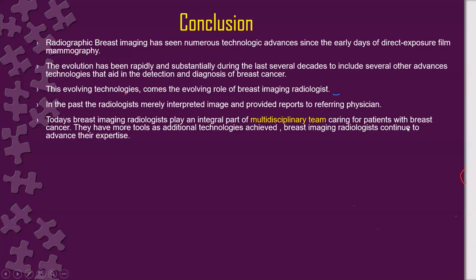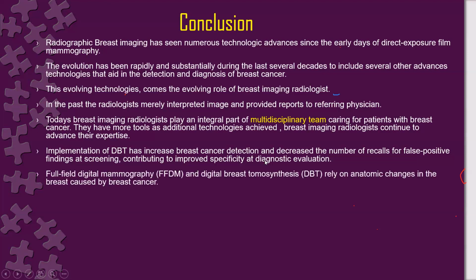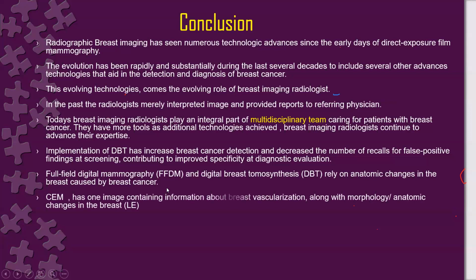Breast imaging radiologists continue to advance their expertise, and the implementation of tomosynthesis has increased breast cancer detection and decreased the number of recalls from false positive findings at screening, contributing to improved specificity in diagnostic evaluation. Full-field digital mammography as well as tomosynthesis both rely on anatomic changes only caused by the breast cancer.